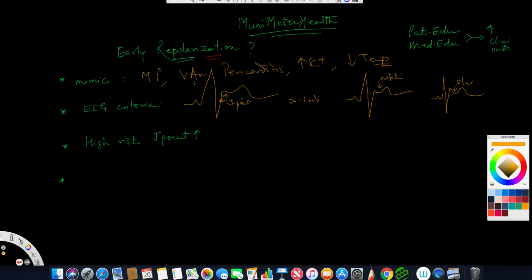Remember that. Ventricular aneurysms, of course, can be ascertained by an echo, and there will be previous histories. Remember, very importantly, for any EKG which you are interpreting, make sure that you also have a previous EKG available if it's been done. If it's not done, obviously you can't help, but if it has been done, it should be retrieved from the medical records of other hospitals or centers, where they can fax it over, scan it over, and send it to you, or sometimes the patients just bring it in their own files. Myocardial infarction, obviously, you have to look at from the enzymes and evolving EKGs while the patient is being watched in the subsequent hours or minutes. A repeat EKG will certainly help. So all of these conditions can be identified, and if early repolarization was mimicking them, then you can make the correct interpretation.